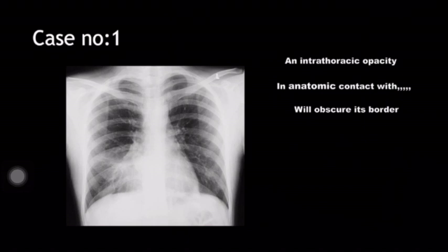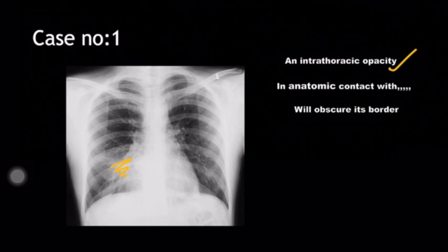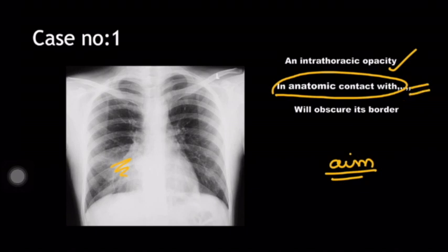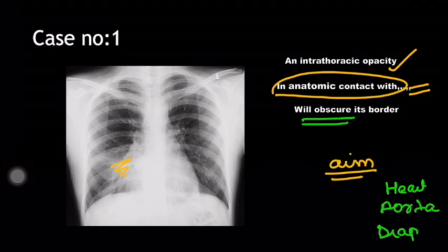So you have an opacity somewhere, and if you cannot see the margin of the diaphragm clearly, it means that the lesion is in contact with the diaphragm — the diaphragmatic outline is lost, so there is loss of Silhouette. We shall see this through a number of examples. In the first case, you have a frontal radiograph with an intrathoracic opacity, so the first criteria is fulfilled. Our aim is to localize it by looking at which structures this opacity is obscuring — the heart, aorta, or diaphragm.